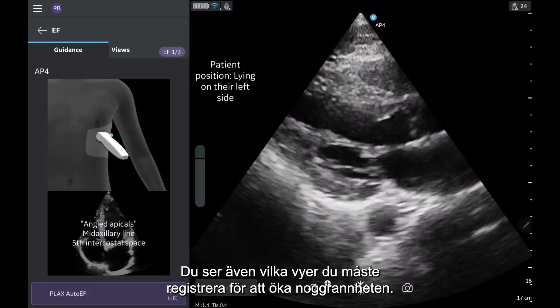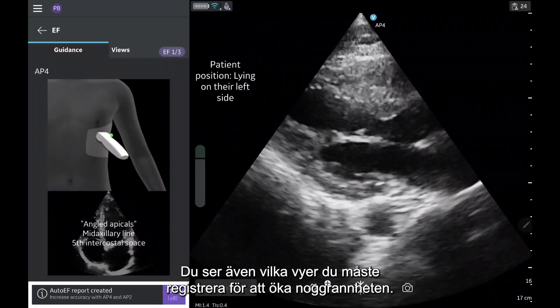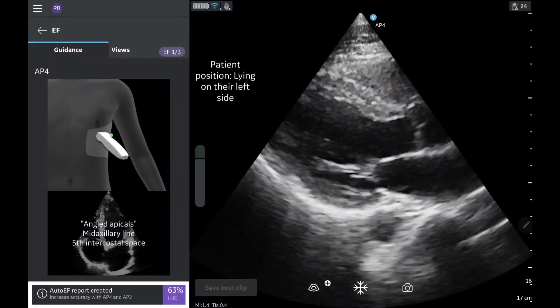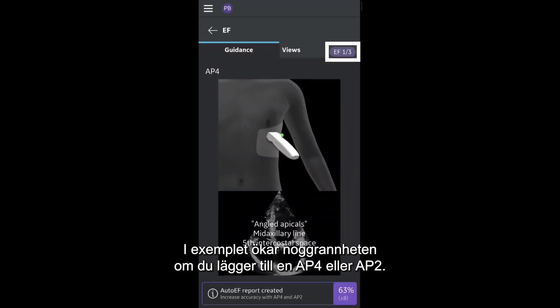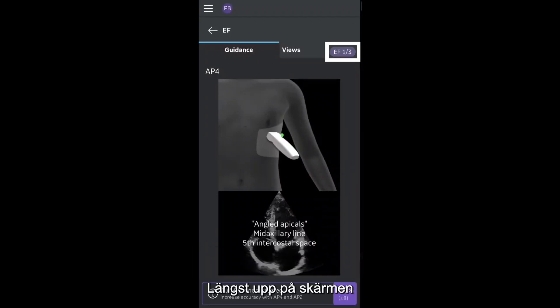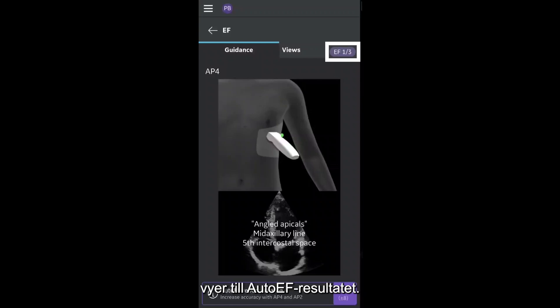You will also see which views need to be acquired to increase its accuracy. In this example, adding an ap4 or ap2 will increase its accuracy. At the top of the screen, you can see how many views you have acquired that are contributing to the auto-EF calculation. Here, one of three views have been captured that can contribute to the auto-EF result.